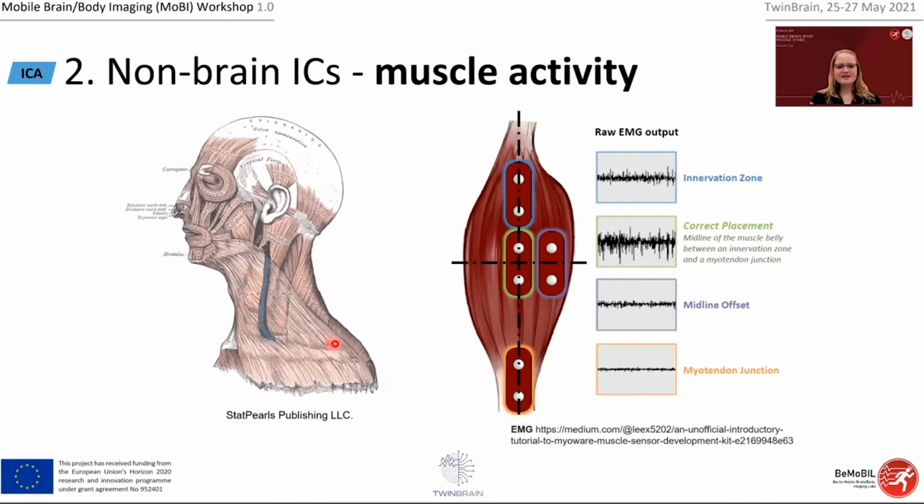So things like that happen, and we just have our electrodes on the head, and we have volume conduction. So it doesn't matter where the electrodes are located, they capture the EMG very well, even if it's not the proper EMG location. But what I want to state with this figure is that we just put electrodes next to our muscles. So there's going to be a lot of muscle movement if we have freely moving participants. And this is something that we see in our data.